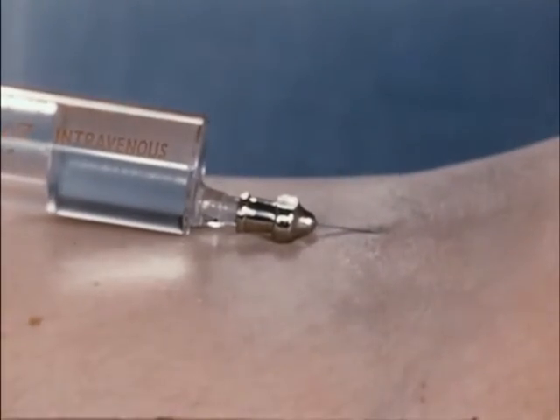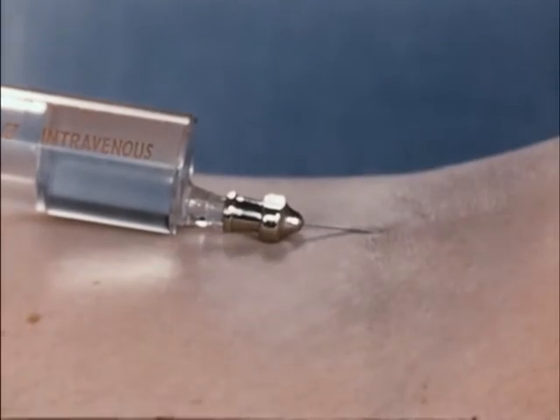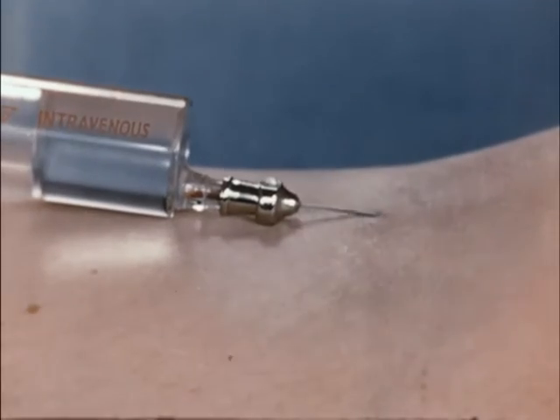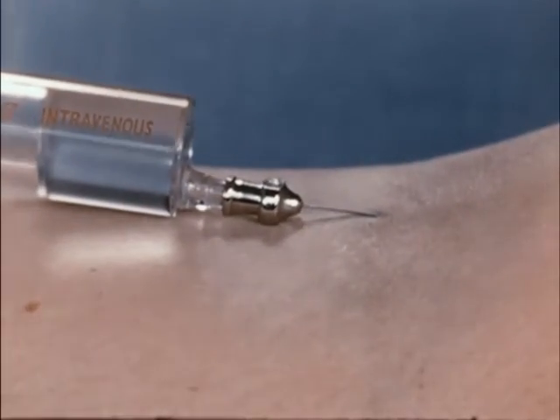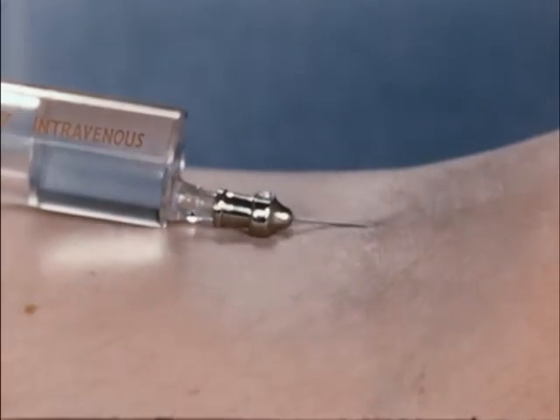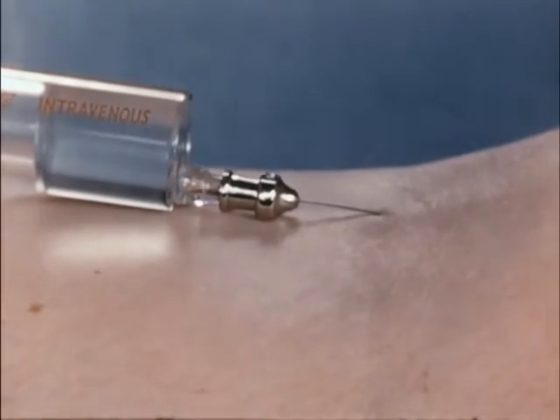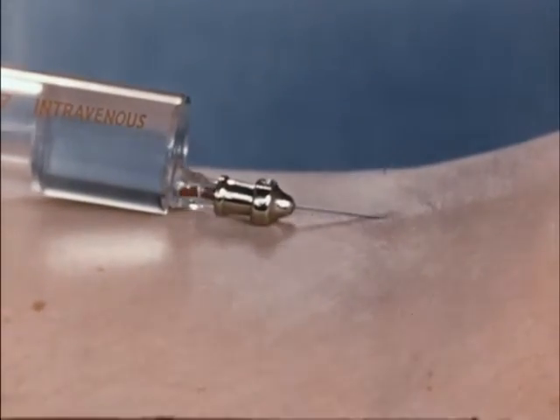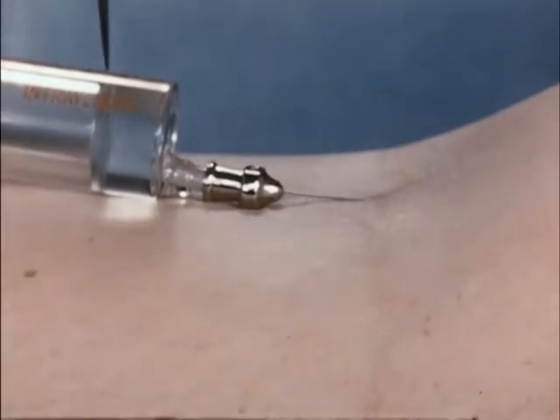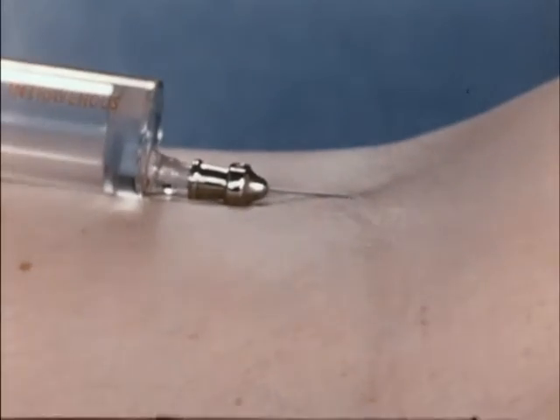If no blood appears, the syringe is moved slightly backward and forward and the test repeated until satisfied the point is free within the vein. The blood withdrawal safety check can be made as often as desired with a pause of but two seconds as shown. The speed of injection allowed by this fine gauge needle is adequate — here is a speed of one millilitre in three seconds, higher than will ever be required in normal practice.